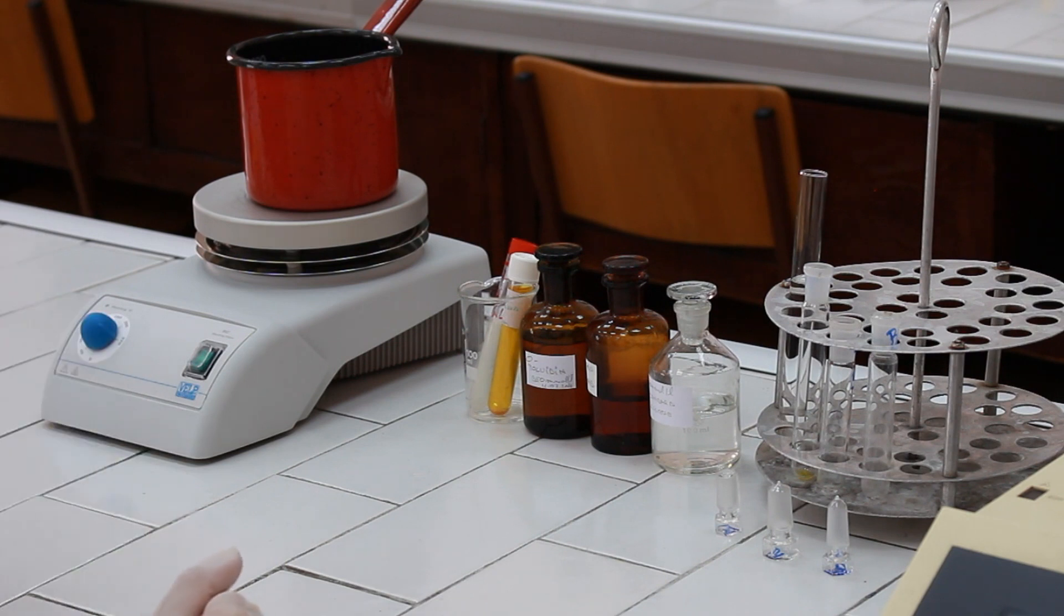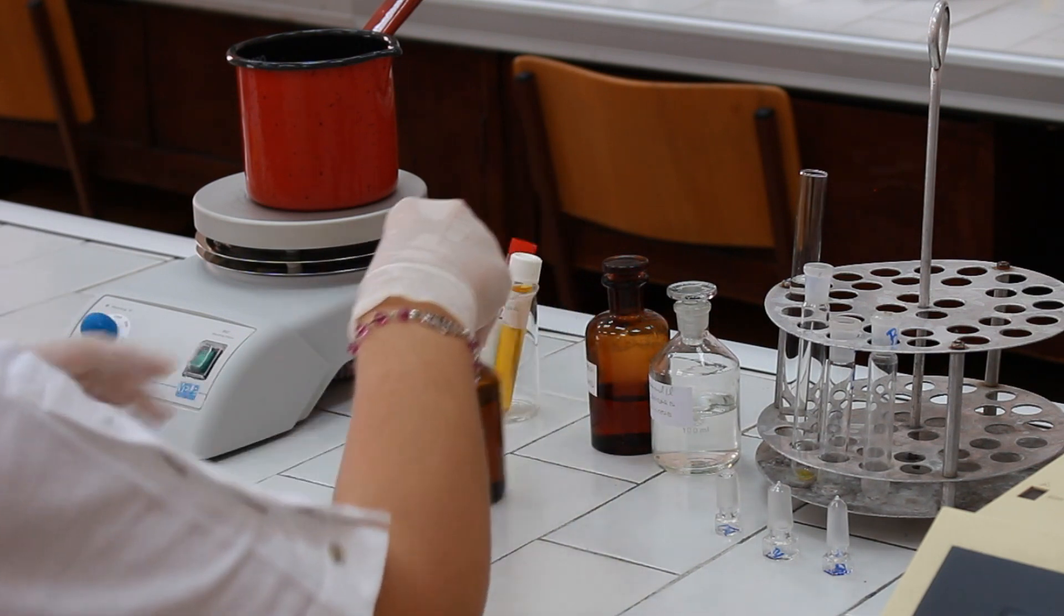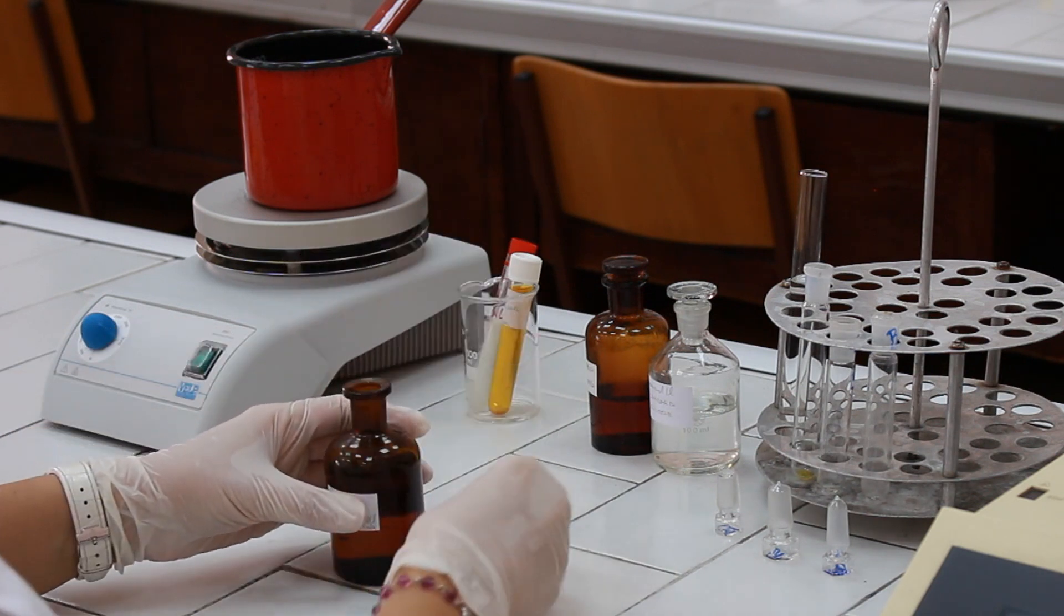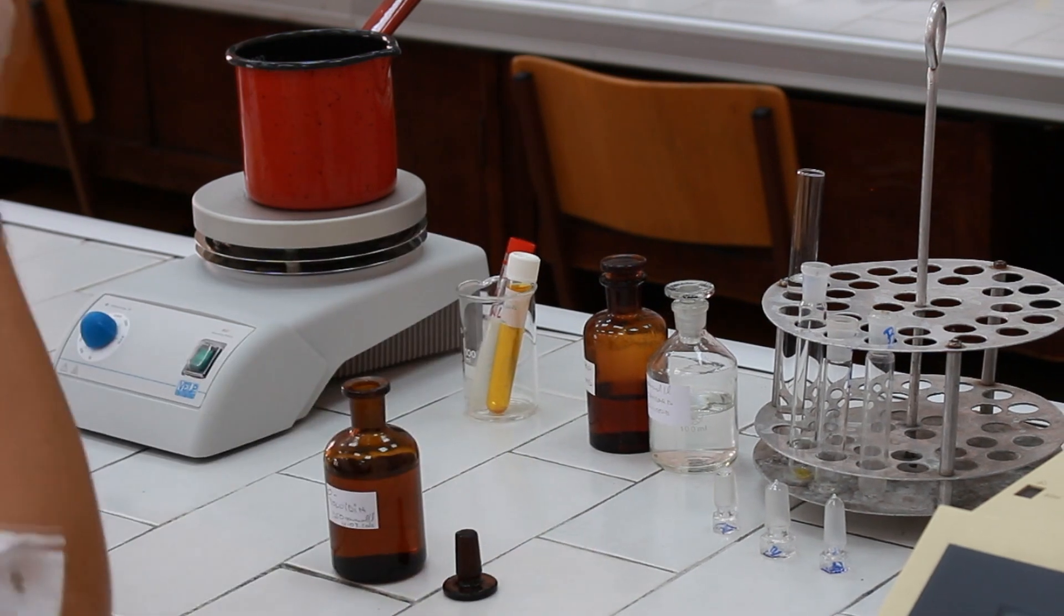Now we need to pipette three and a half milliliters of orthotoloidin to each test tube.